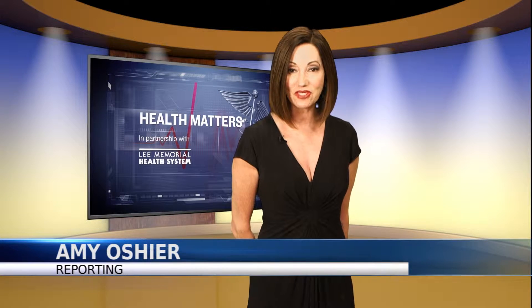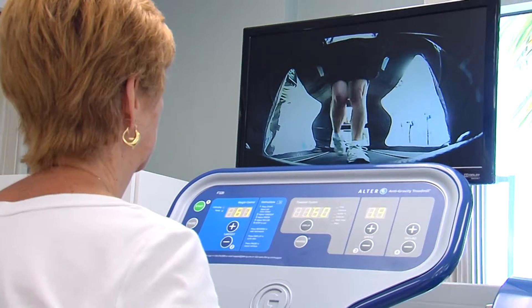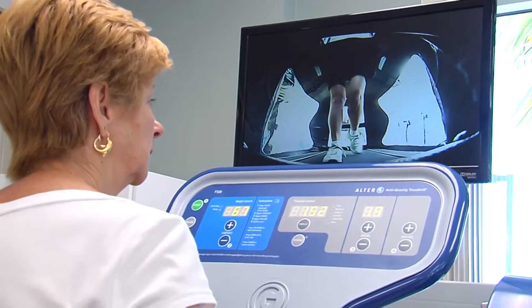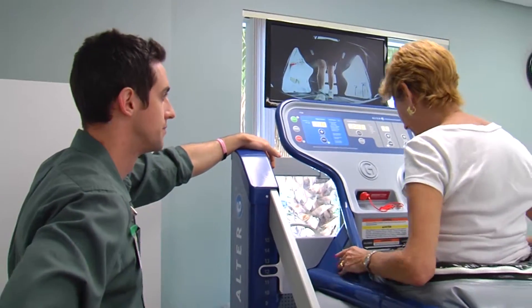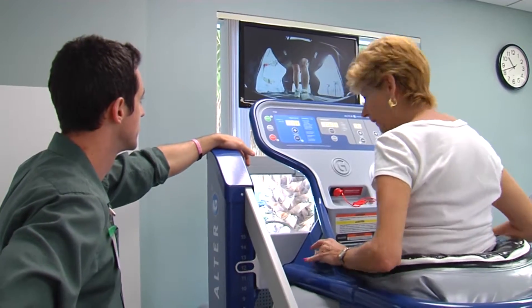providing a safe environment but also giving therapists a unique view of progress using a high-tech camera system to speed up rehab. We have three different camera angles so we can tell when we start to bring the weight off when their gait pattern normalizes. We can show them in real time how they're walking so they can start to make adjustments and walk more normally in the AlterG.